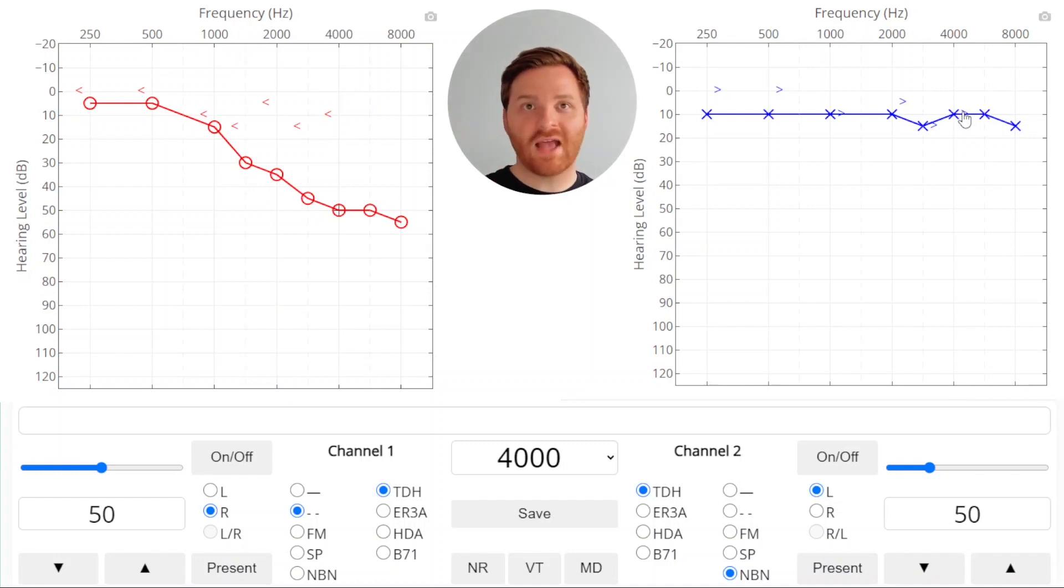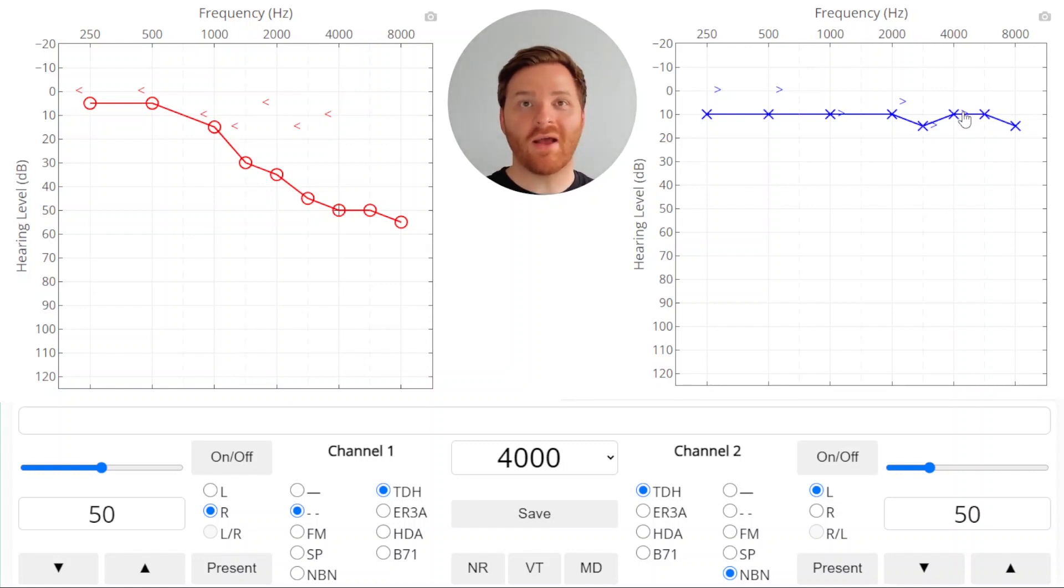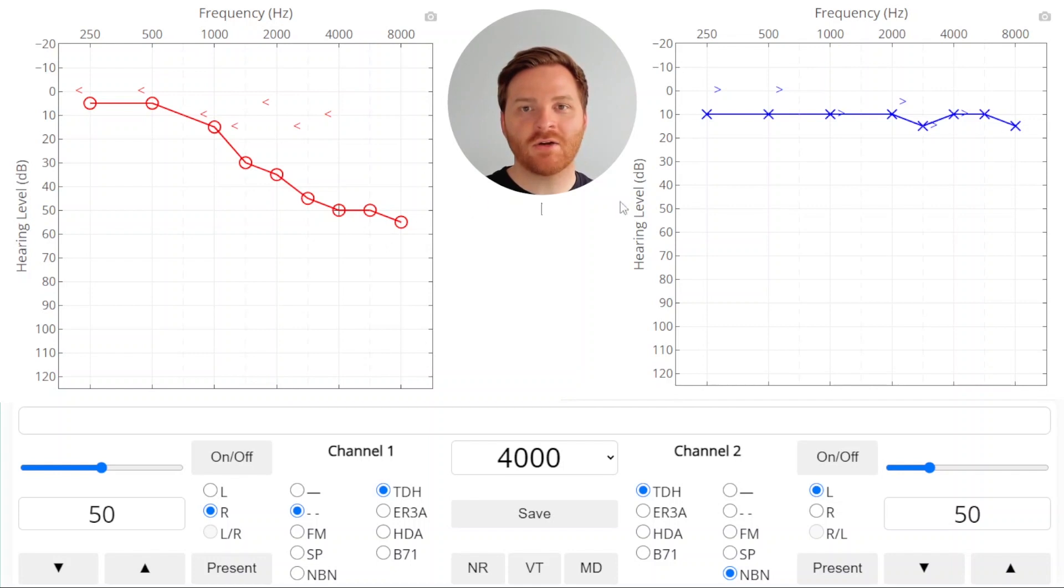So the sound, the crossed over sound and the threshold are at the same level. So it's possible that that crossover sound was heard by the non-test ear. So in that case we're going to need to mask for air conduction to cover up that non-test ear and make sure that the response that we got in the test ear was true. So let's do that.